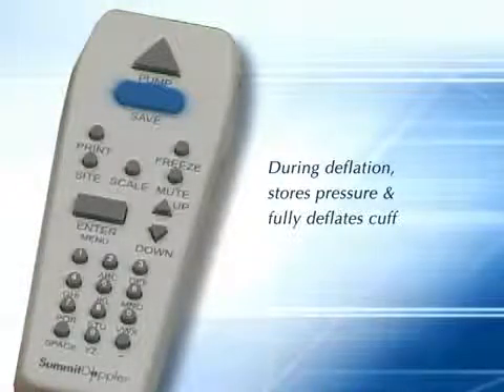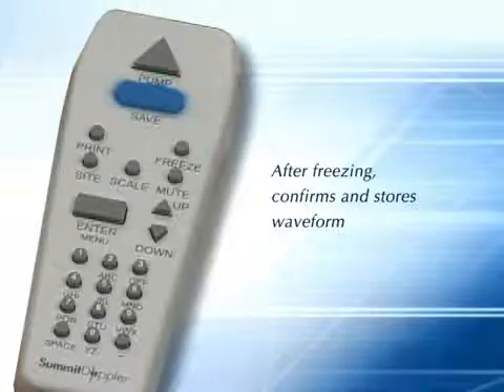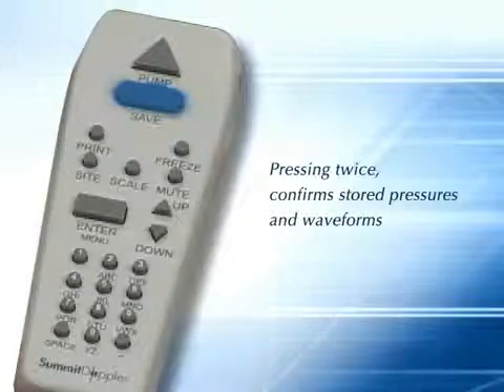The save key has multiple functions. By pressing save during deflation, the systolic pressure is stored and the cuff fully deflates. Pressing save during an active wave form stores the wave form data. Press save after freezing a wave form to confirm and store it. Pressing the save key twice records the stored pressure or wave form.